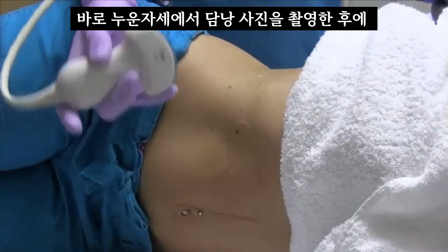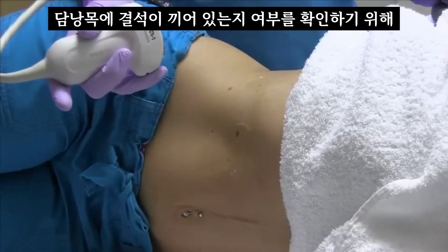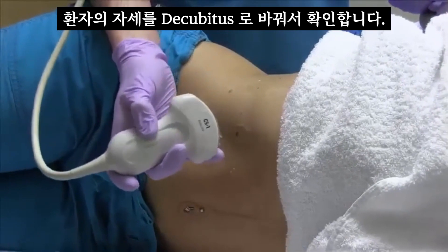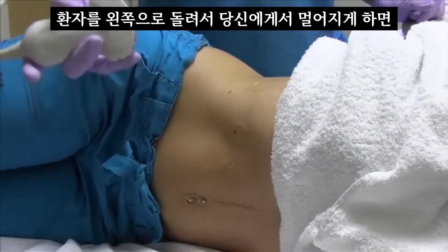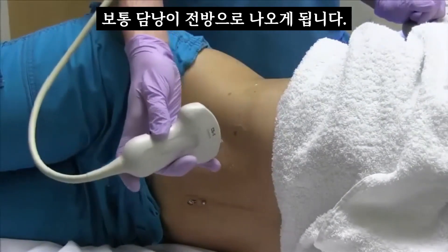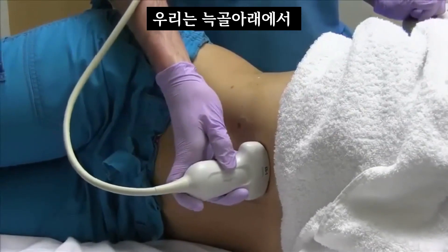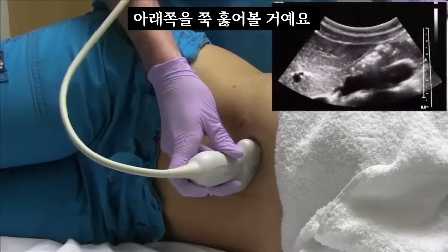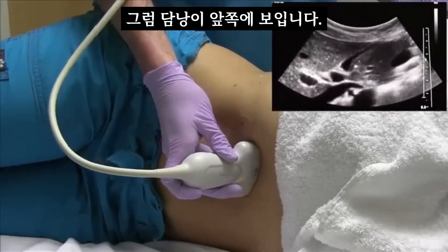After you get your supine pictures of the gallbladder, you want to make sure you decubitus the patient just to make sure there are no stones stuck in the neck of the gallbladder. Have the patient turn on their left side away from you — that usually brings the gallbladder forward. Come subcostal here and sweep through; you should see the gallbladder very anterior.